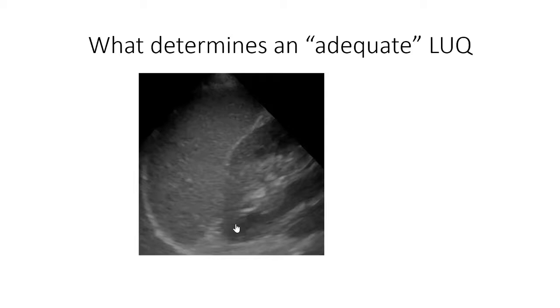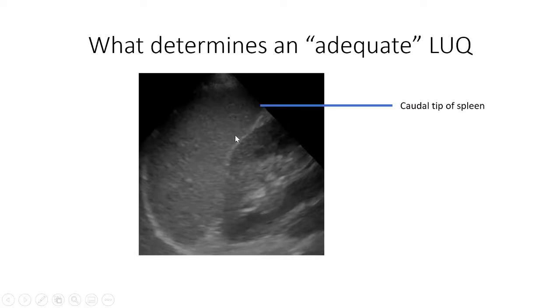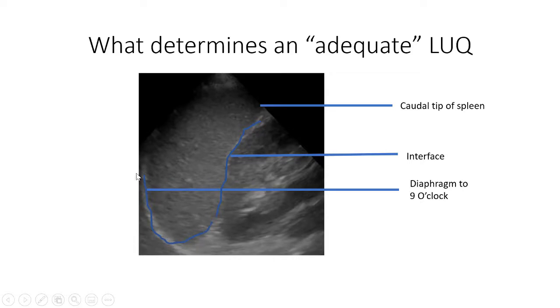The left upper quadrant is trickier. You need to see the diaphragm because fluid is more likely to accumulate between the diaphragm and the spleen. You also need to see the interface and the caudal tip of the spleen. You need to see the diaphragm all the way up to about nine o'clock of the kidney - if you drew a clock in the kidney, you'd need to see to nine o'clock. If you can see the diaphragm to that point with no fluid between the diaphragm and the spleen, no fluid in the interface, no fluid at the caudal tip, and the kidney disappears on both sides when swept, you can call that a negative scan. Fluid anywhere in the interface, subdiaphragmatic area, or around the caudal tip is a positive scan.